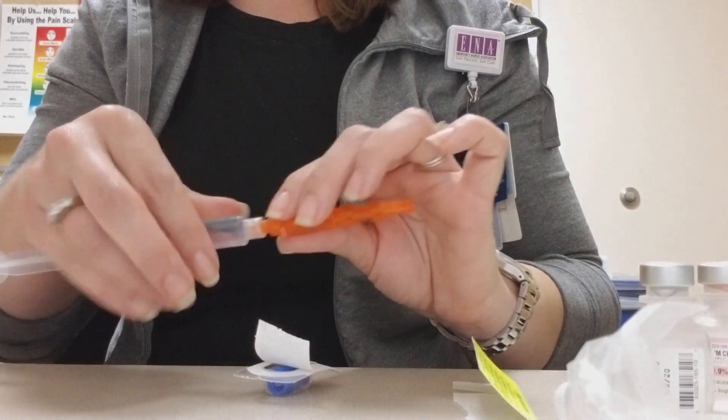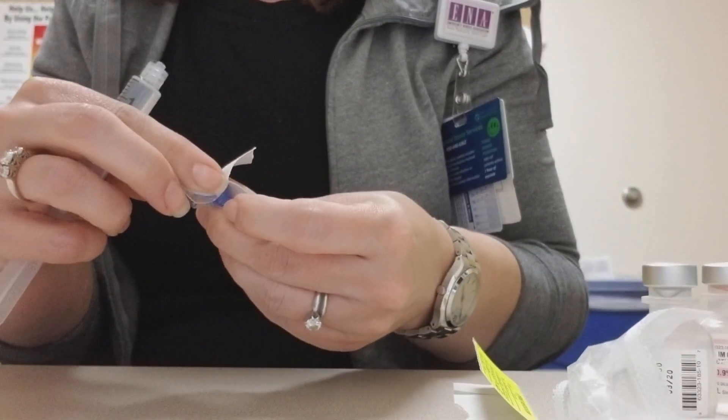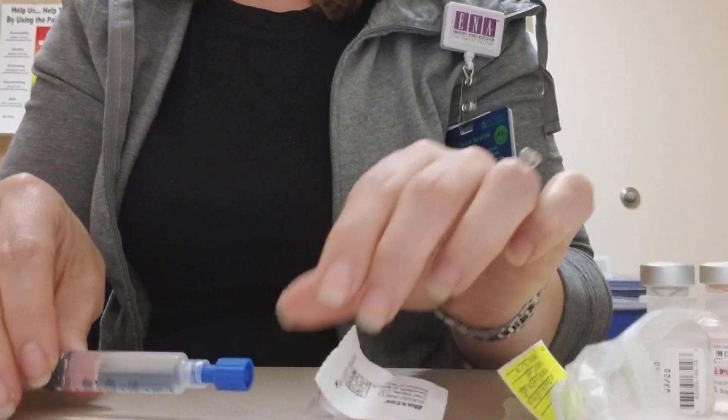I'm going to discard this vial — it is a one-time use. At this point I can use my blue cap to discard the needle so I can bring it to my bedside safely.